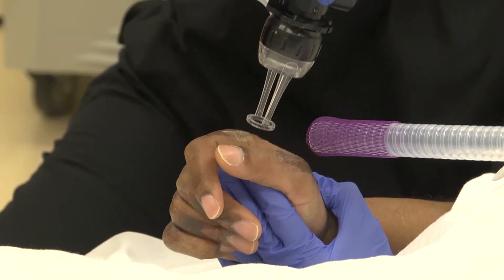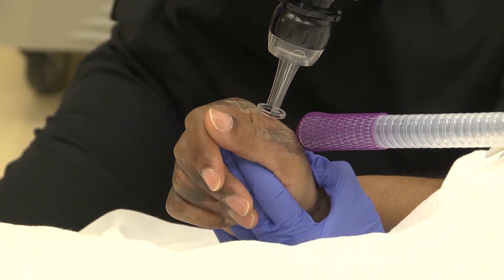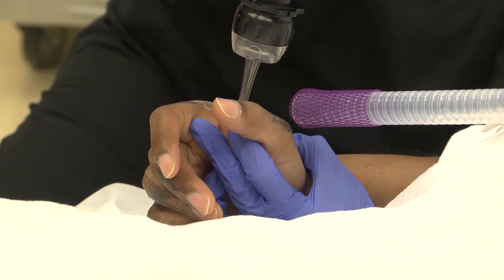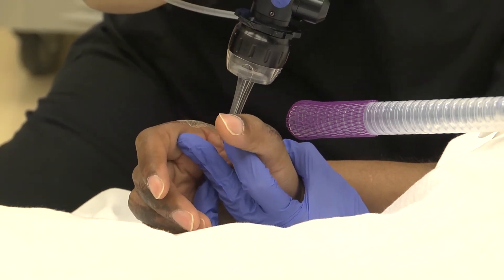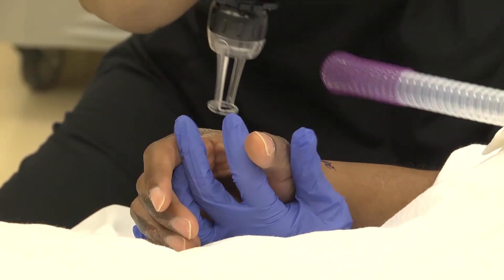What we're doing is lasering these scar bands so that when it comes time to doing actual reconstruction with surgery, we can do a simpler operation. In a sense, this is preparing him for additional surgery that he might need.